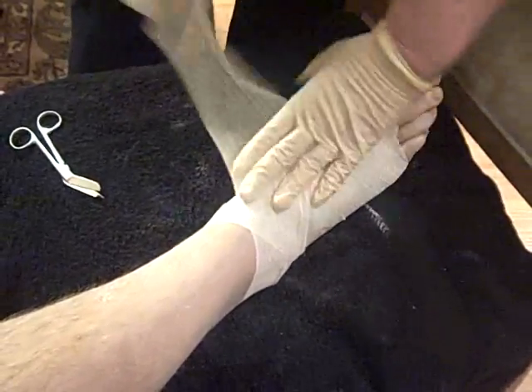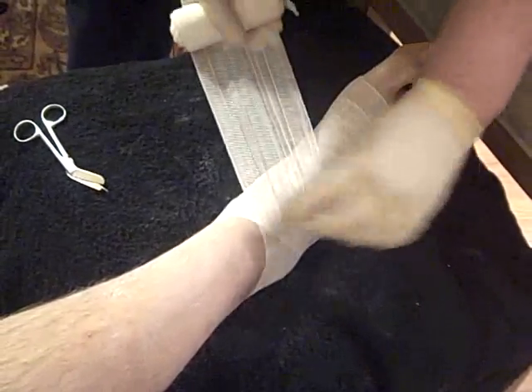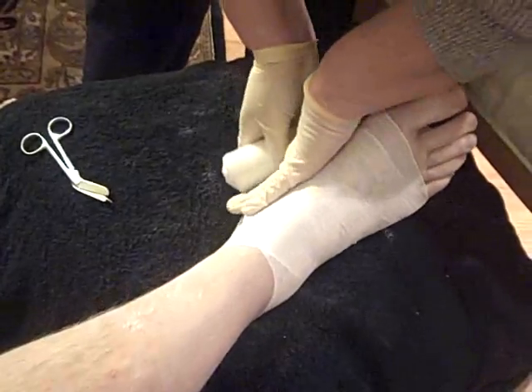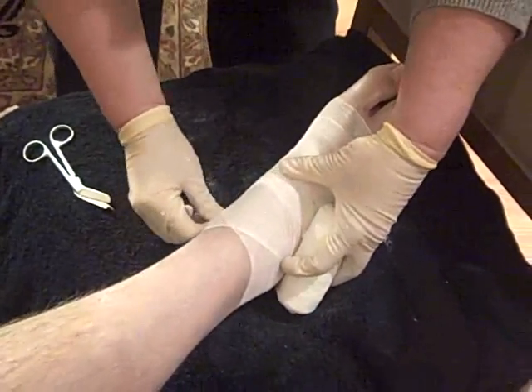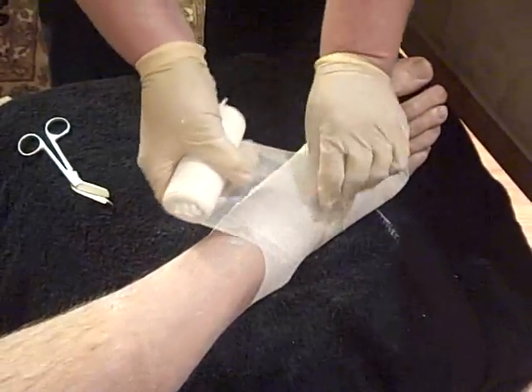Another very important thing to remember when doing an Unna Boot is that you want to make sure that you get all the wrinkles out. Because if you leave wrinkles in there, one of the specific features about the Unna Boot is its rigidity, and you don't want it hardening with wrinkles because then you can cause problems.